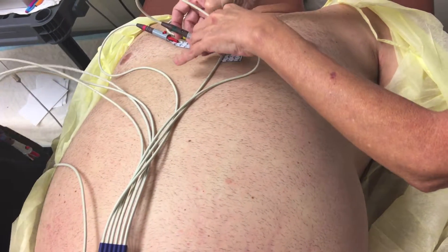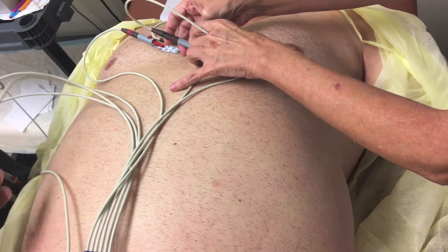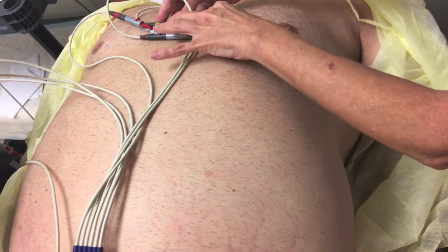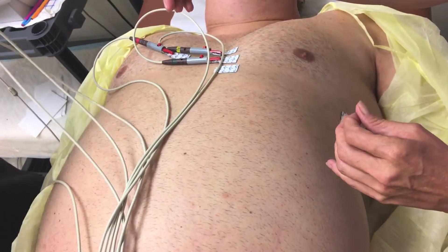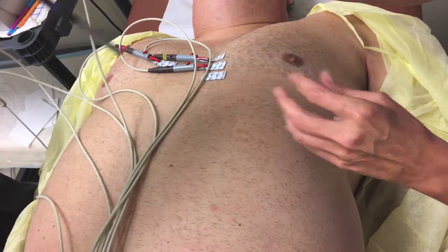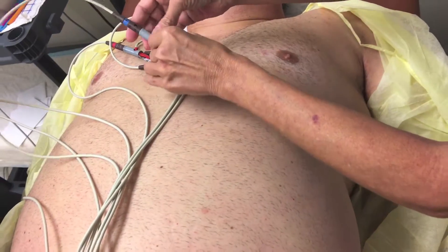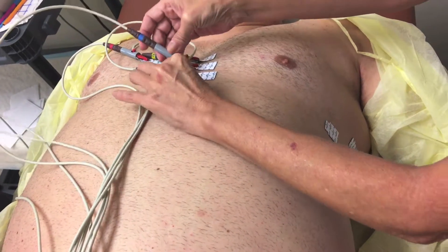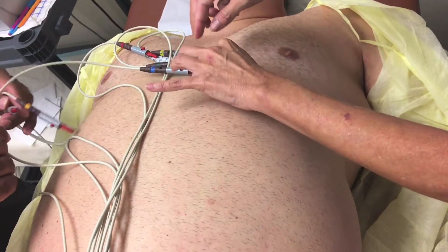Now, the hardest part is trying to get them to stay because the person is hairy or extremely sweaty. If they have oil or baby powder, anything like that, you need to clean the area well with alcohol. And sometimes if they don't stick, you can always use a little bit of tape.